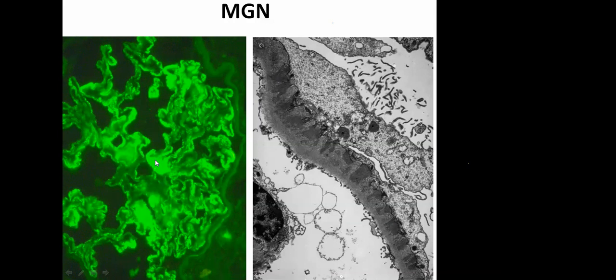If somebody asks whether these deposits are surely along the glomerular capillary loop or also in the mesangium: in this case, if you look at this immunofluorescence, there are bright granular deposits along the capillary loop, but in some areas it appears that in the mesangium also there is some staining. The glomerulus is a three-dimensional structure, so in some sections it might appear that the deposits are in the mesangium, but actually they are only along the capillary loops.